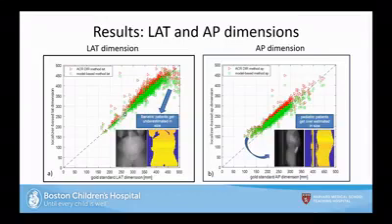I have kind of a stupid question, so it might not make sense. For image gently, and I guess this is what this is related to, you want to measure up front what your patient's specific dose is going to be so that you can adjust what you're going to give them. But just on the scanner itself, does that mean you don't use auto mA type stuff? Because the scanner wants to do some variable thing, how do you enforce what you want, practically speaking, on the scanner? Yeah, that's why these groups are actively involved in reverse engineering a lot of these AEC algorithms. So they can put in a smart algorithm that does the same thing but more patient-specific? Yeah. So you can't routinely just do it on a commercial scanner now?